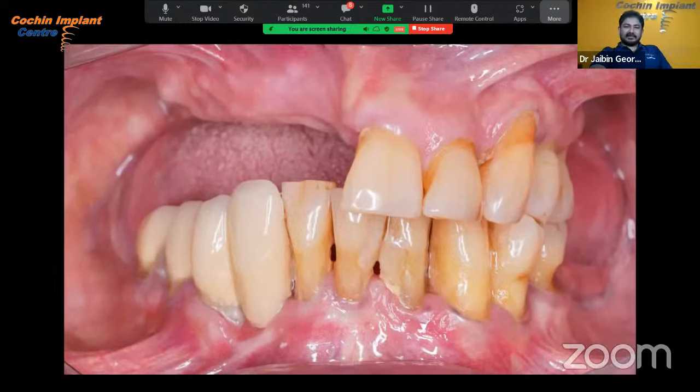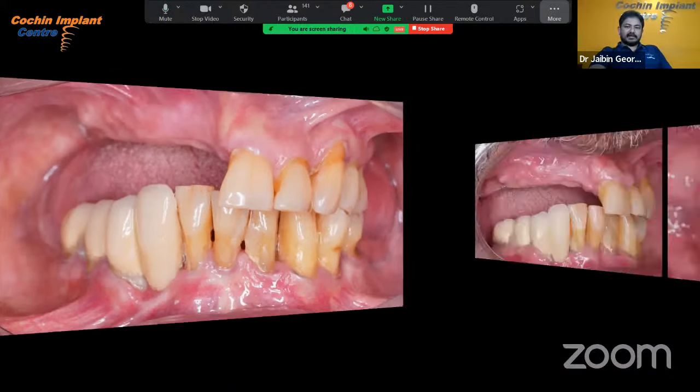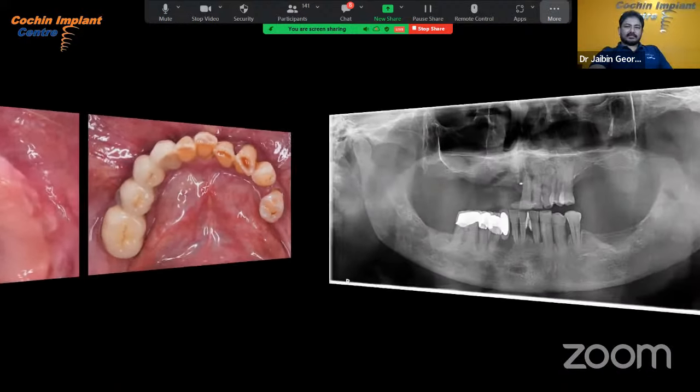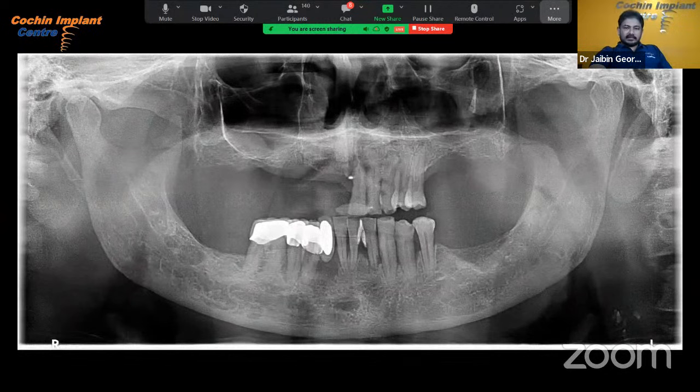This is a case where we did upper all on 6. This is the pre-op photograph of the case. This is the pre-op radiograph. You can see the maxillary sinus has come down. So we plan to tilt the implant like this on both sides. That is the all on 4, all on 6 technique, and load it immediately.